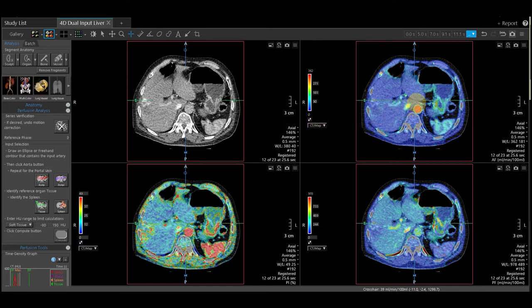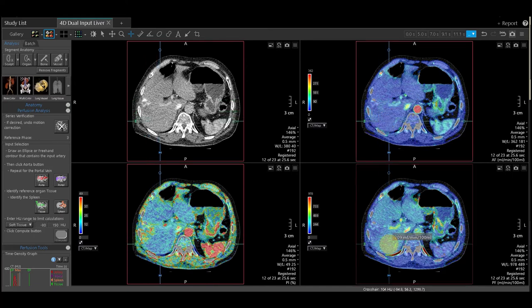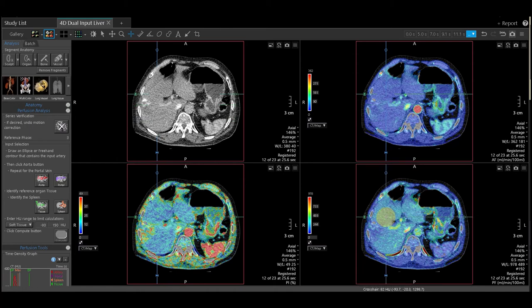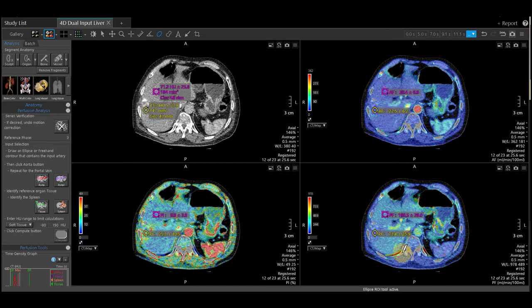On your maps, by holding your left mouse down, you can get voxel information for each individual map. Or come up to the main toolbar, select your ROI, and draw a region of interest over your area of interest to get specific numbers for comparisons on any specific part of your liver.